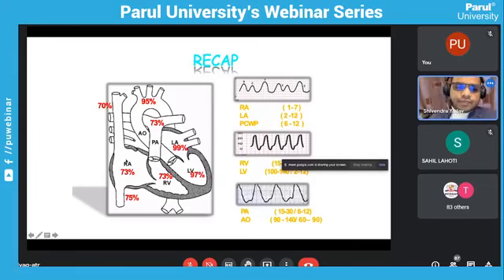Now if you get oxygen saturation of 70% and 75%, but in the right atrium suddenly you get 85% or 90%, then there can be a connection between the left heart and right heart. This is how the diagnosis was made for atrial septal defect back in the days when echo was not a helpful diagnostic tool. This is how they used to diagnose the ASD.